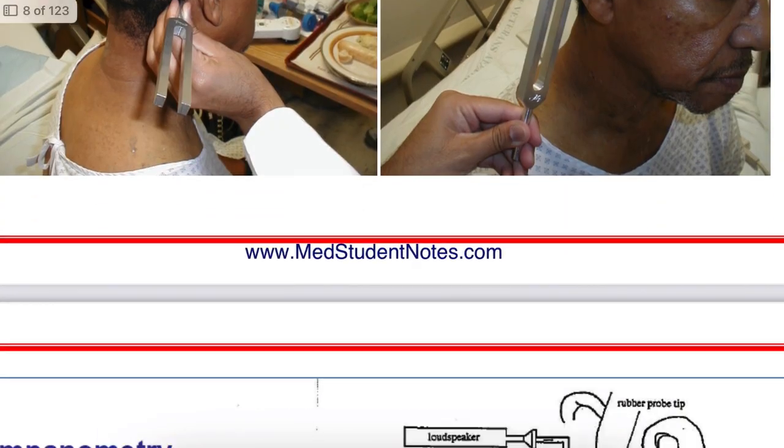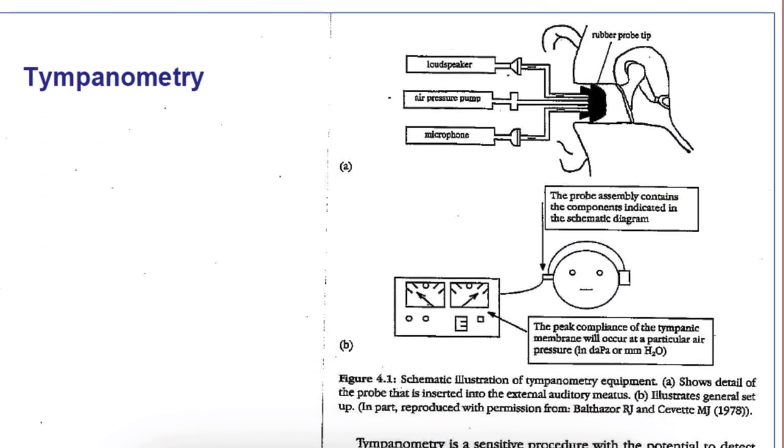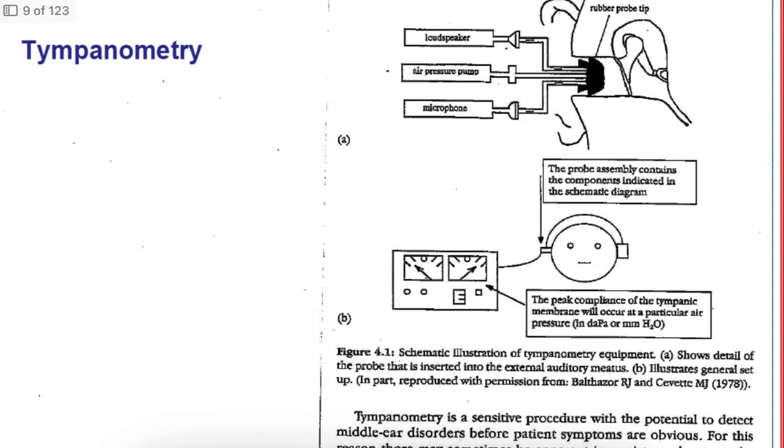And we have some advanced hearing tests. Pure tone audiometry helps to measure the hearing threshold and differentiate conductive versus sensorineural loss. Speech audiometry helps to assess speech recognition. And impedance audiometry, also known as tympanometry, as you can see here, helps to check for middle ear infection.